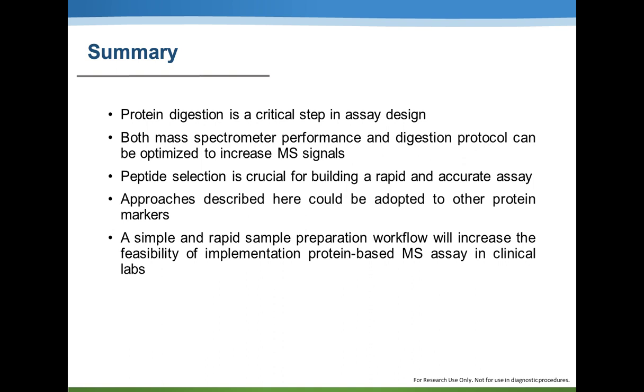And we, in the lab, Dr. DeMarco's lab at St. Paul's Hospital, actually use the same strategies applied to our development of a thyroglobulin mass spectrometry assay.